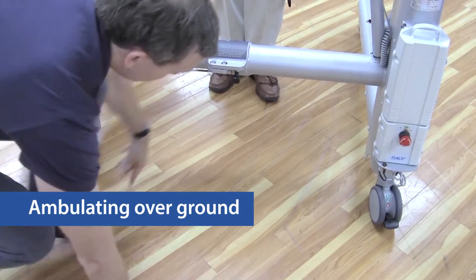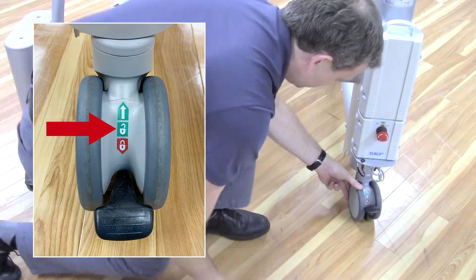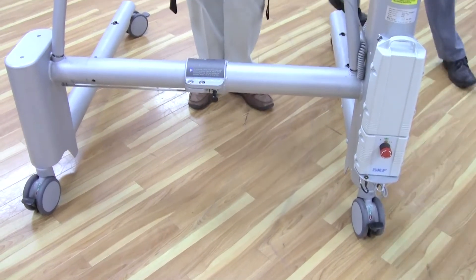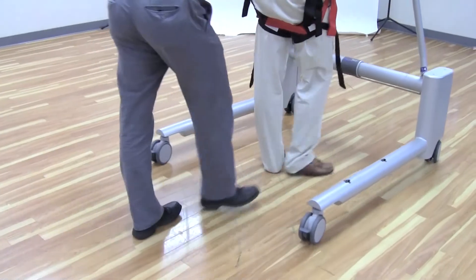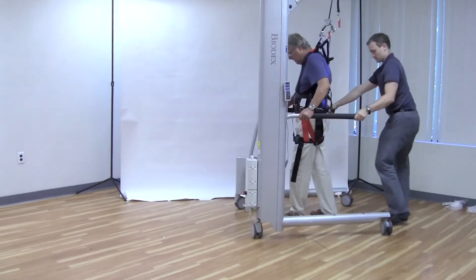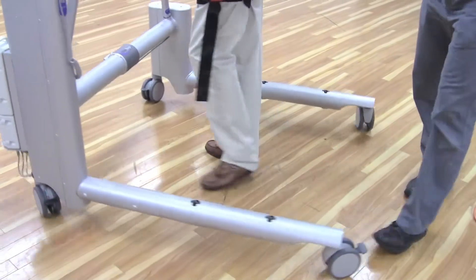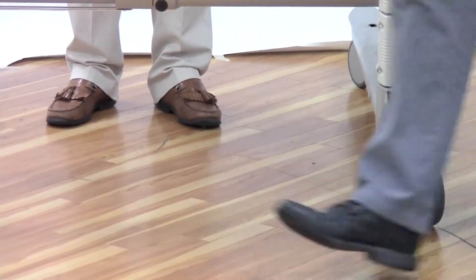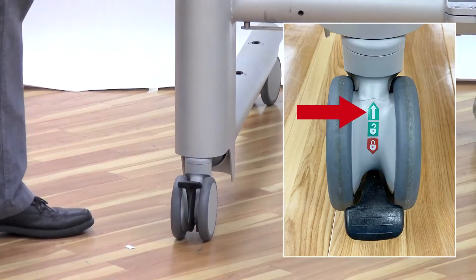For maximum maneuverability in tight spaces, unlock the rear casters and set the front casters to the second set. To help control a patient's steering over longer, straighter distances such as a hallway, set the front casters to be directionally locked in the forward position.